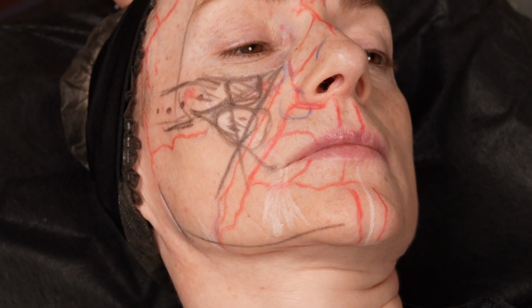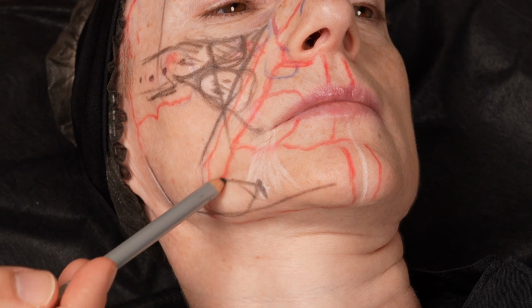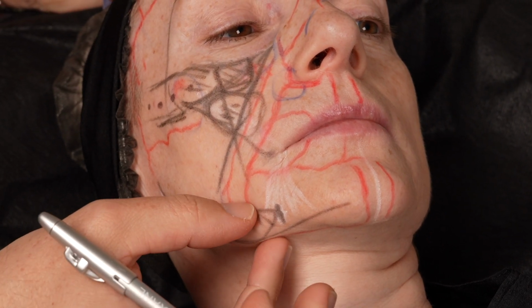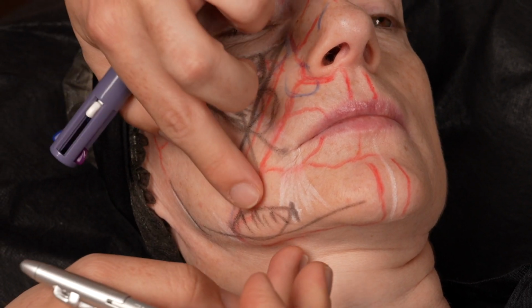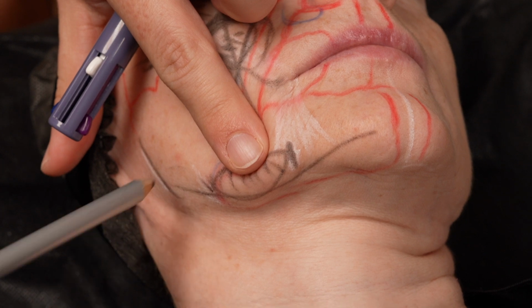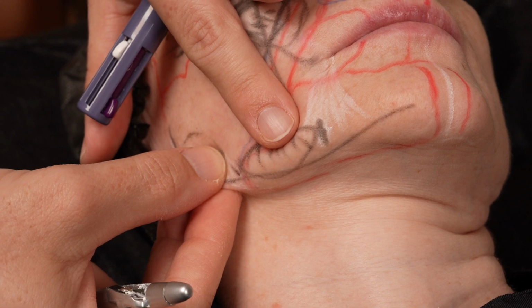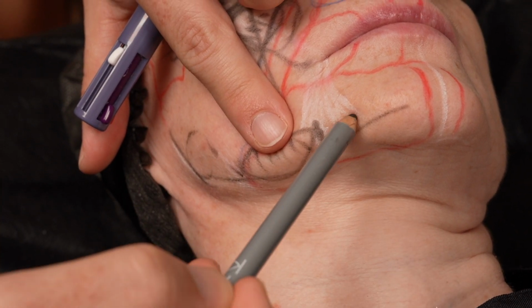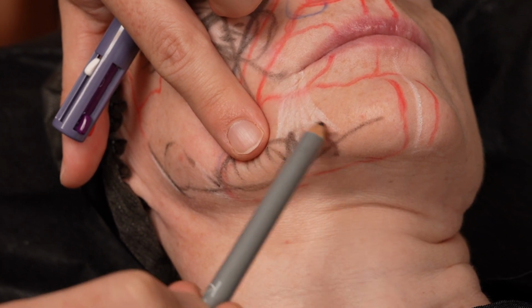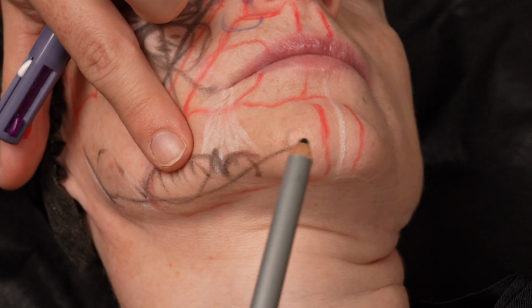In the lower third, here is my jaw, for example. I told you between this ligament, here is the sagging, especially in old patients. So my aim for the rejuvenation is to hide this sagging. If it goes down, my plan is to give volume here and also to give a little bit of volume at the corner. I told you it helps for a little bit of lifting effect. And I have lack of tissue in this fixed point, the prejaw sulcus. My aim is also to fill a little bit of the prejaw sulcus, and sometimes the chin area is needed.